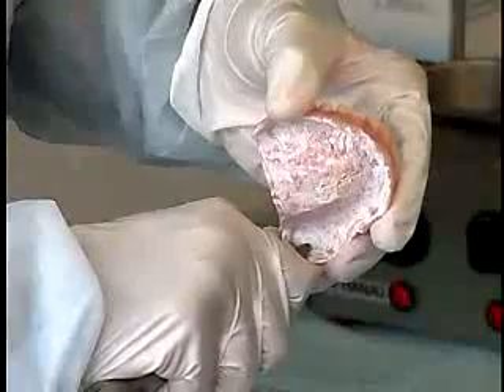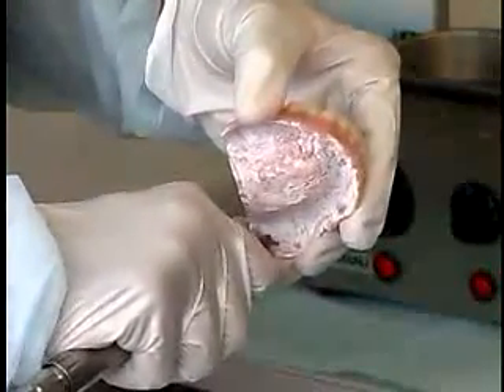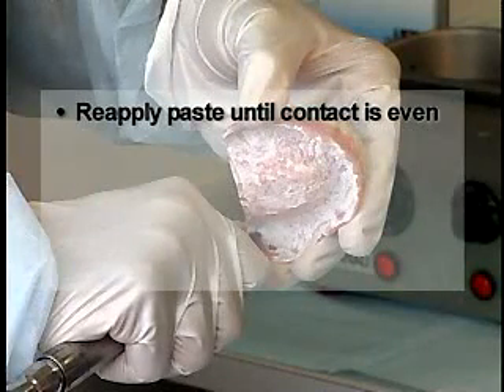Relief these areas. Re-apply the paste until the denture contacts the tissue surface evenly.